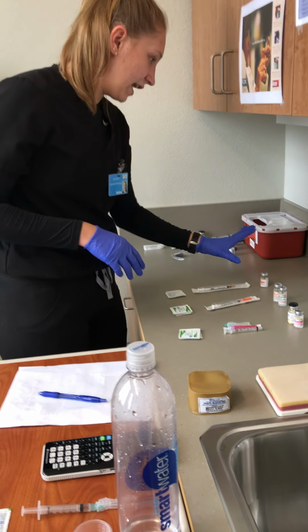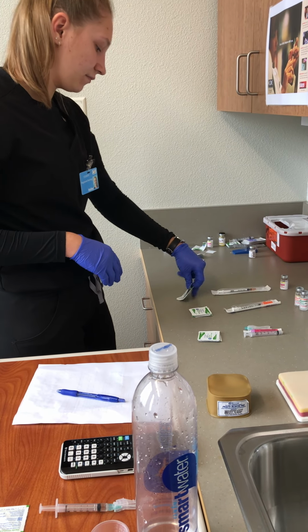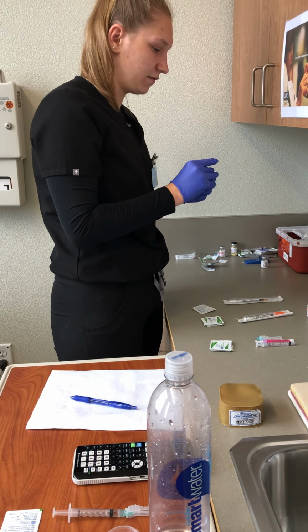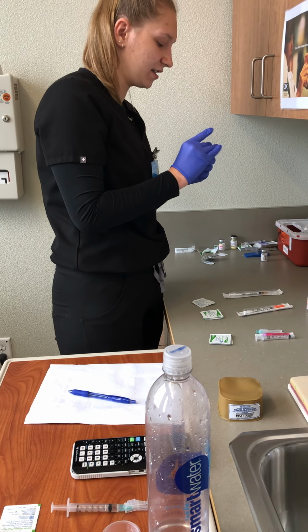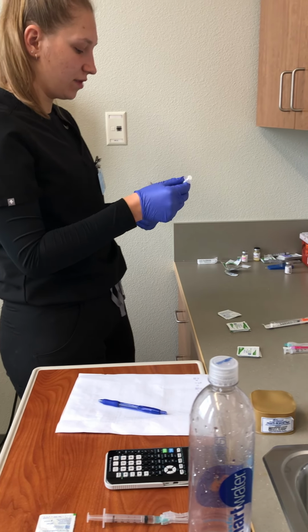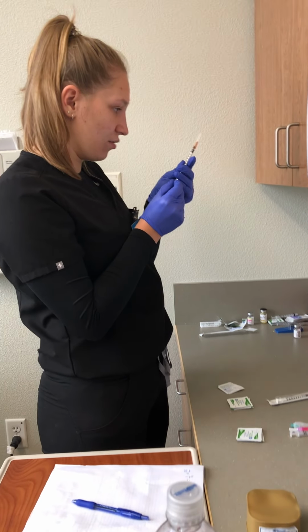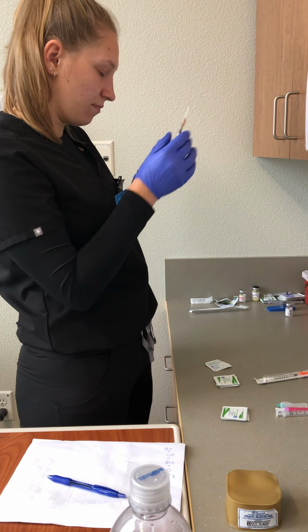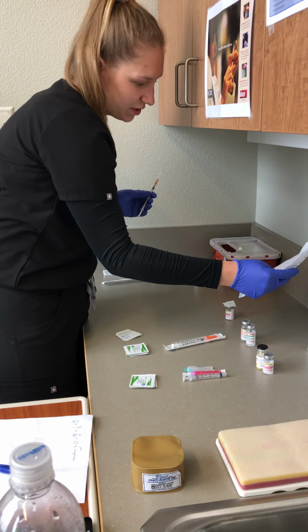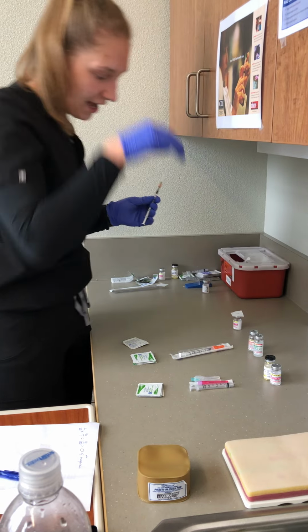Okay, so now I'm going to go ahead and prepare my tuberculosis test. I'm going to swab clean the top for 20 seconds, or 10 to 15 seconds. I'm going to leave that on there. I'm going to prepare my syringe. I'm going to be getting 0.1 milliliters because I've checked on here. I need 0.1 is my order, and I have available 0.1. So I'm going to go ahead and draw that up, and I didn't have to do any math for that one.